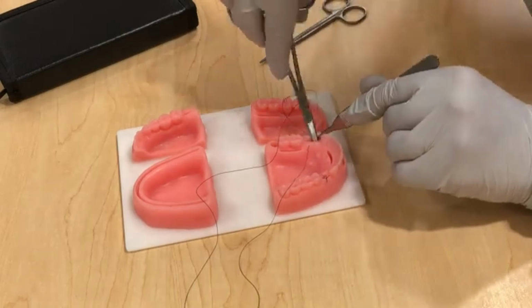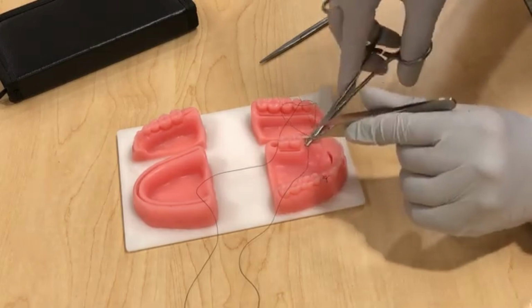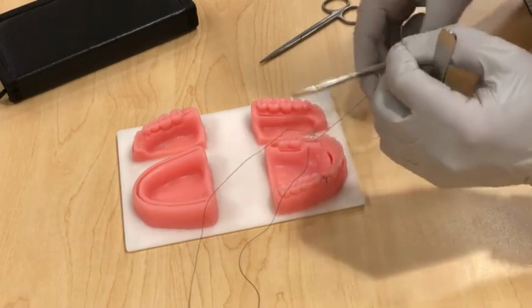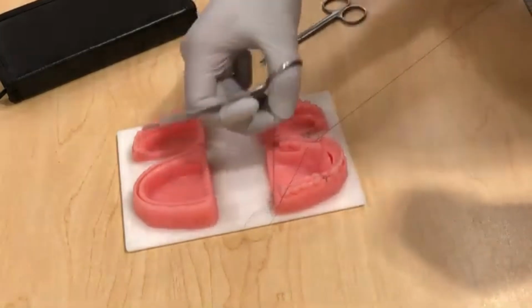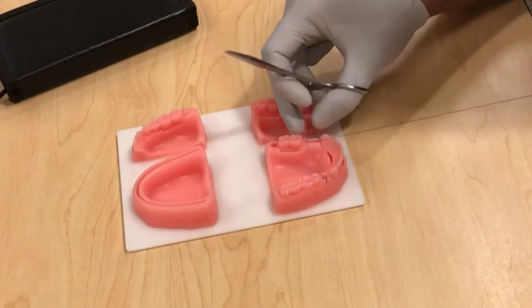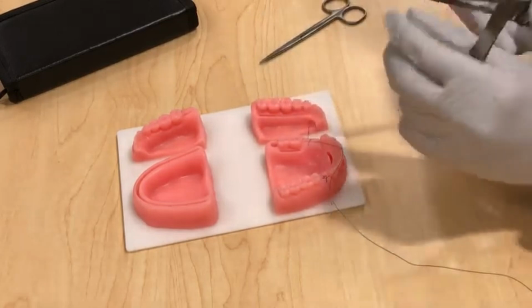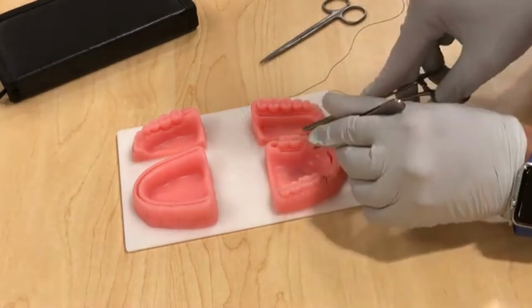Don't push it, it's gonna do its job. Alright, you don't want to grasp the needle with the tissue forceps because it's not designed for that. Okay, have enough room. Okay, and this is called figure of 8 because, as you will see, you'll have a kind of figure 8 shape. Do the same principles. Hold the tissue like that.